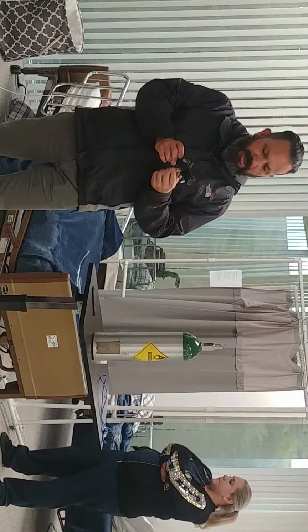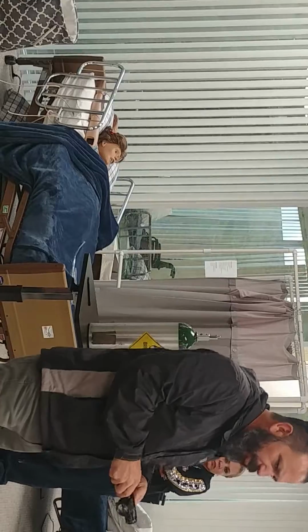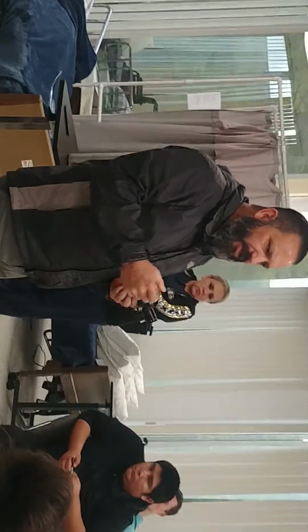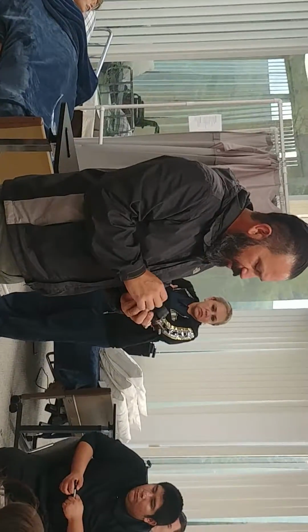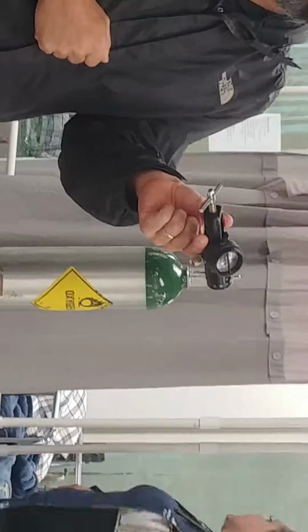Before we get into the actual swapping portion, I just want everybody to take a look at the regulator. When we practice, you get a chance. You have your gauge here where it talks about oxygen and the pressurization. Just like anything else, it's just a gauge. Where the needle shows is telling you how much you still have to utilize.